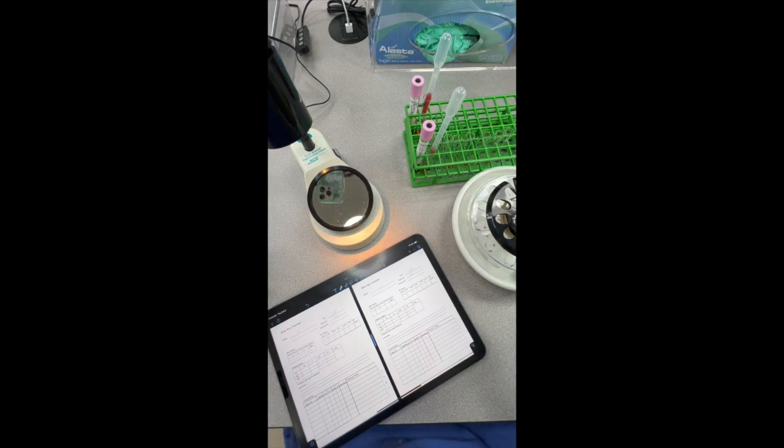We'll look at this. Okay. And our patient's type, since our anti-A and our anti-B did not react with the patient's cells, that front type appears to be O. And just as we expected, because the patient doesn't have any antigens on their red blood cells for the AB and O grouping, they made the antibodies to A and B cells. So we're going to put the patient type as an O.